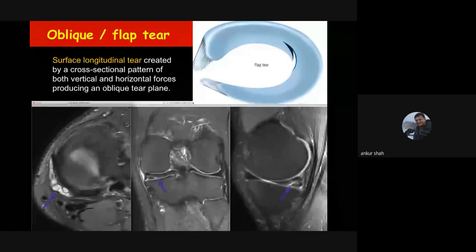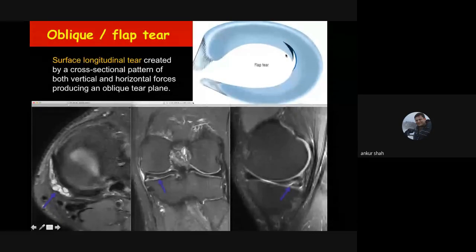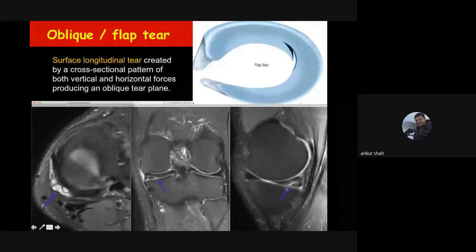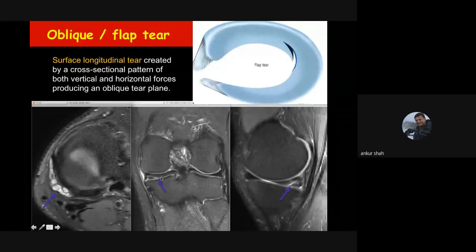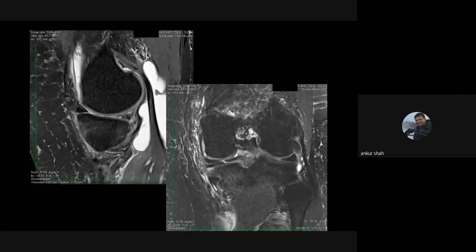There is also the non-displaced flap tear, which is like a relatively oblique horizontal tear reaching up to the free edge of the meniscus. On MRI it appears as a hyperintensity that is oblique in orientation reaching up to the free edge. This can be associated with a parameniscal cyst and is known as the oblique flap tear.